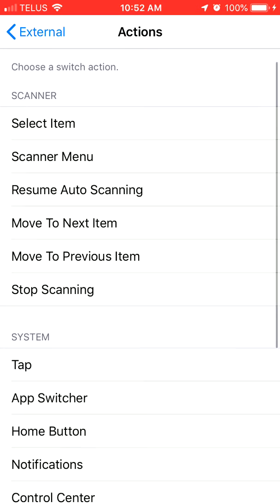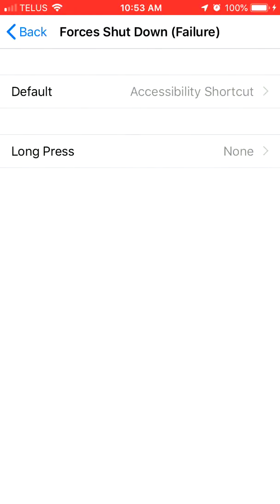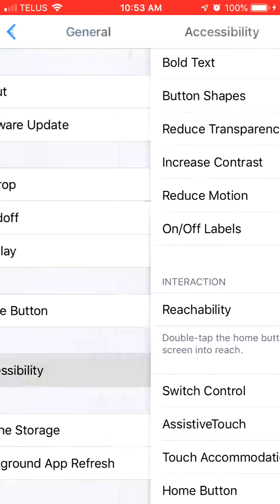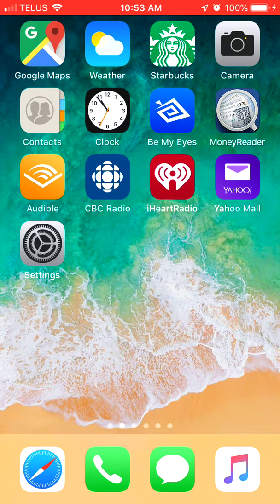And the function that we're going to assign here is Accessibility Shortcut. And this button will not have any long press associated with it. So at this point we can press back. And your screen, when you've added all of the functionality of all of the buttons of the VISAIDE Smart Cane 5000's button interface, your screen should look as this screen does right now. And then you can just exit out of settings, and you're one step closer to being able to utilize the VISAIDE Smart Cane 5000's iOS switch control.